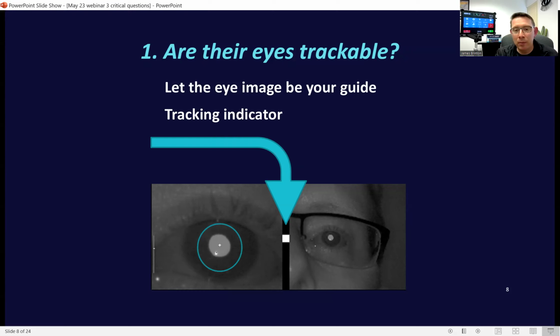The Eyegaze Edge has a camera that you manually focus and gives you full control over the clarity that that image, the eye tracker, is seeing. Here we see that pupil is centered in the image. We've got a clear delineation between the pupil and the iris, and this image is focused so much so that we can see their eyelashes even. This is a great clear image.